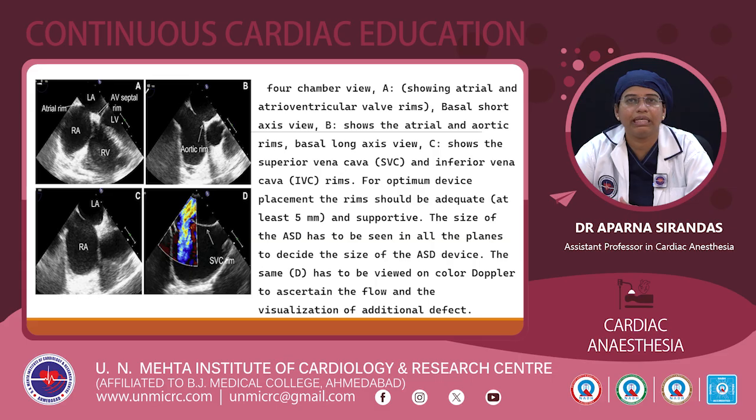The size of the ASD has to be seen in all the planes to decide the size of the ASD device. The same D figure has to be viewed on the color Doppler to ascertain the flow and the visualization of the additional defect.